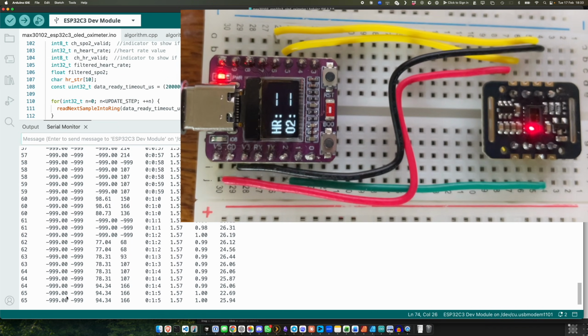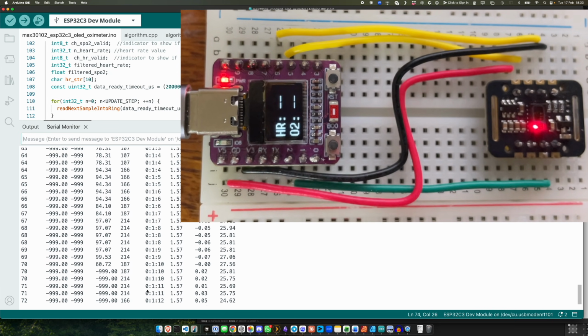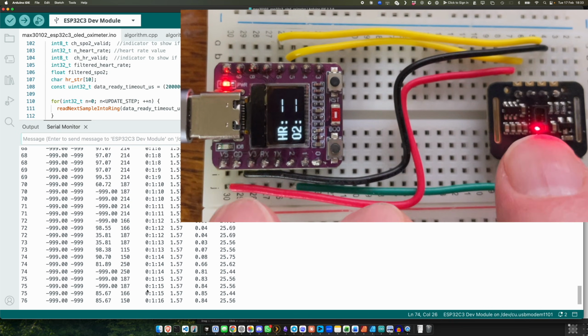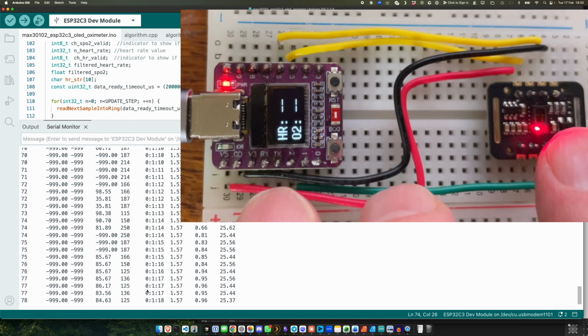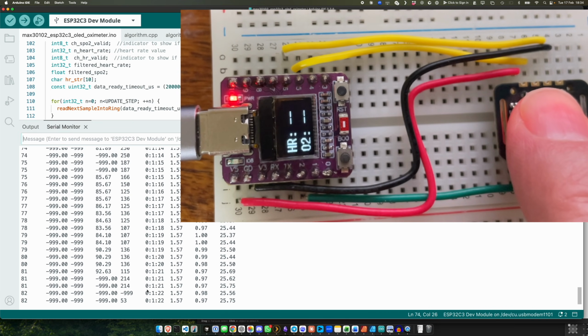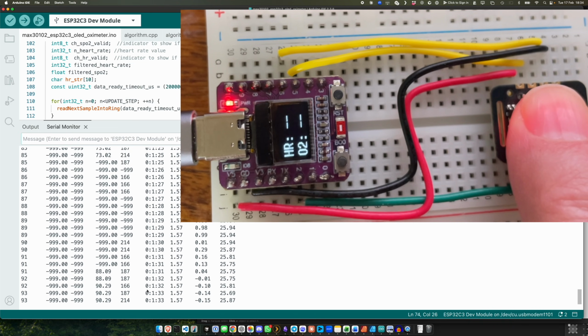So I've got a sketch uploaded here that should be reading from the sensor. You can see it dumping out a whole bunch of stuff on the serial monitor. I've got it hooked up to a nice little display here, so heart rate and oxygen levels. Let's stick my finger on top of the sensor and see if we can get some readings to come out. It can be a bit pernickety about finger placement and keeping it very still, but hopefully it should slowly settle and start producing some results.